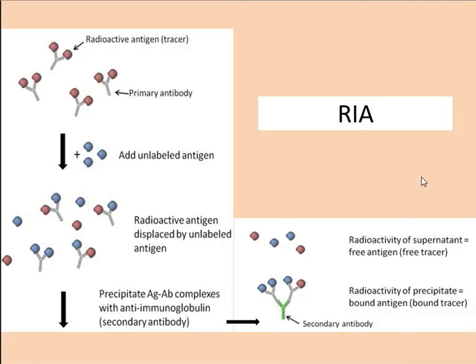The antigen in the serum sample will compete for the antibody binding sites. And who is it competing with? It is competing with the labeled antigen.